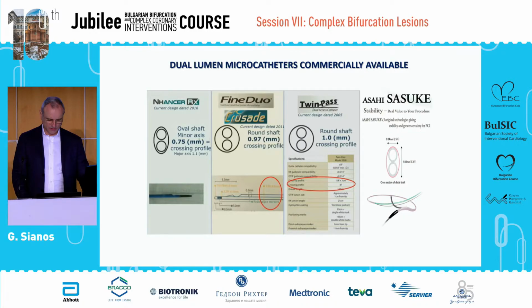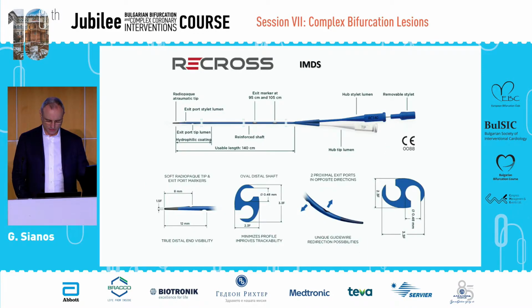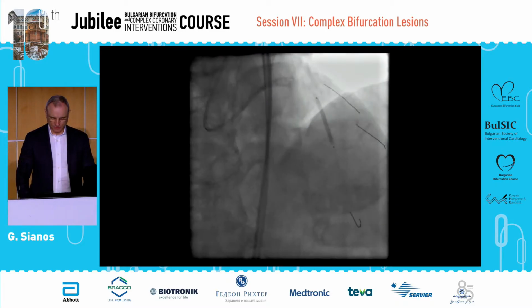Just an overview of the currently available dual lumen microcatheters. I'm not going to get into that, but they're playing a very important role in the treatment of CTOs in the context of bifurcations, or bifurcations in the context of CTOs. This is the only one true dual lumen microcatheter. I'm not going to get into details of this.